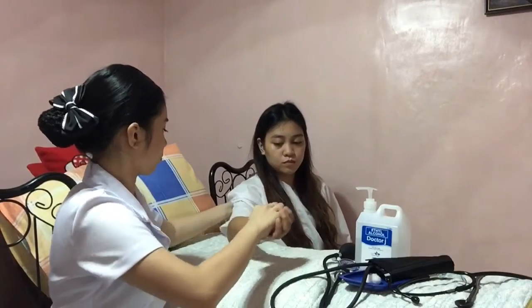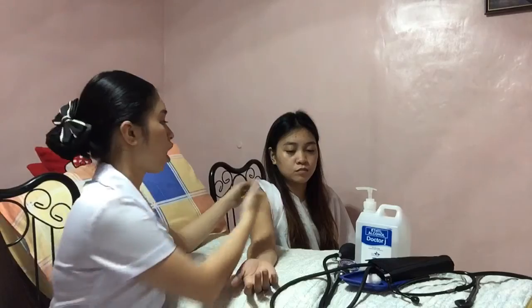The client should be sitting unless otherwise specified, and the feet should be on the floor. So slightly flex the arm. So the palm facing up with the arm supported at heart level and expose the upper arm. So now ensure that the equipment is intact and functioning properly. So check for the cuff size, the tubing between the cuff and the bulb, and the sphygmomanometer.